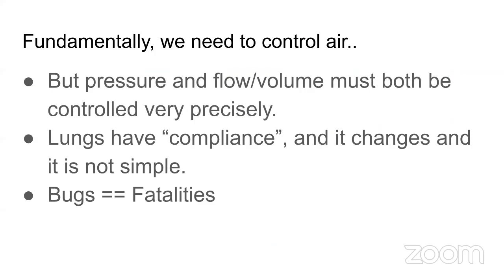Fundamentally, the problem of ventilators is to control air. It seems very simple, but that's the truth. But the pressure, flow, and volume must be controlled very precisely. It is a fact that acute respiratory distress syndrome, or ARDS, which is the primary thing which kills you if you have COVID-19, requires very careful control of pressure and volume.